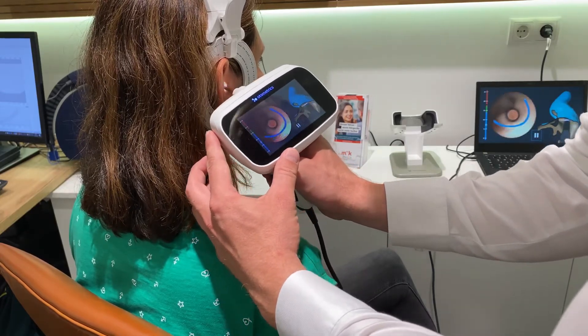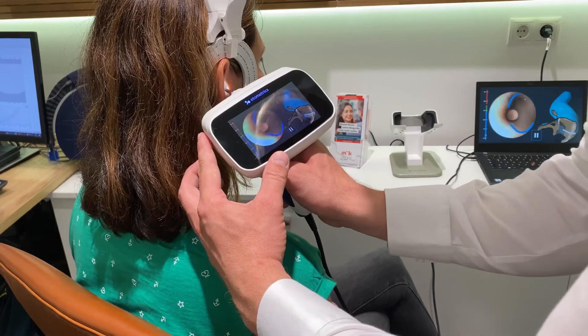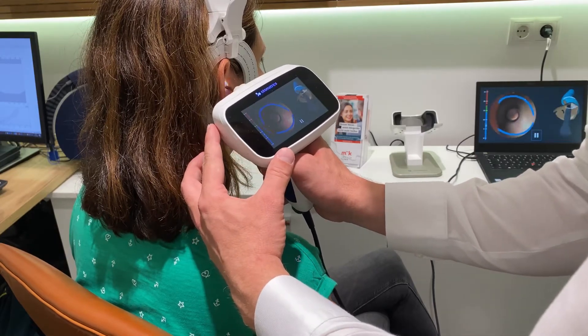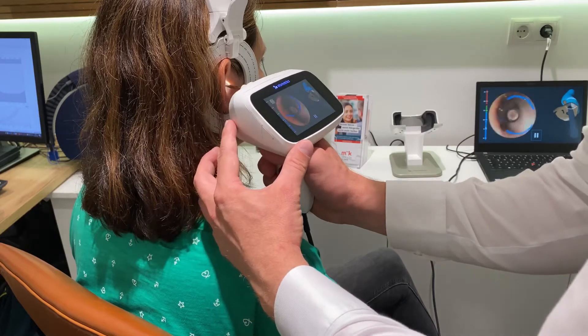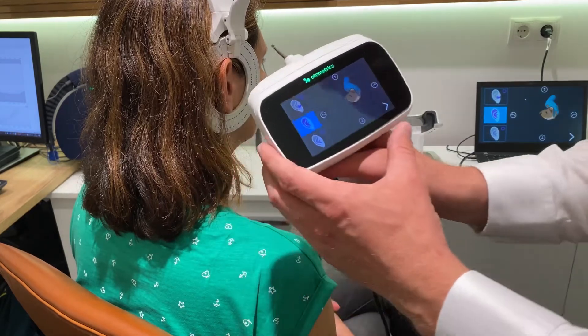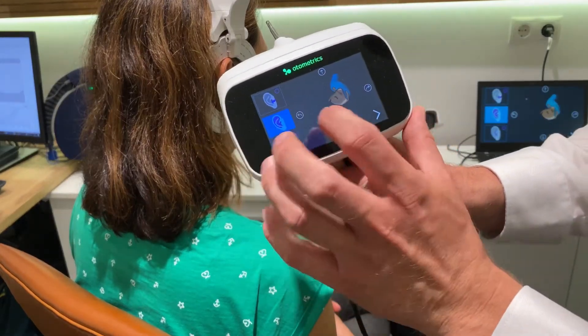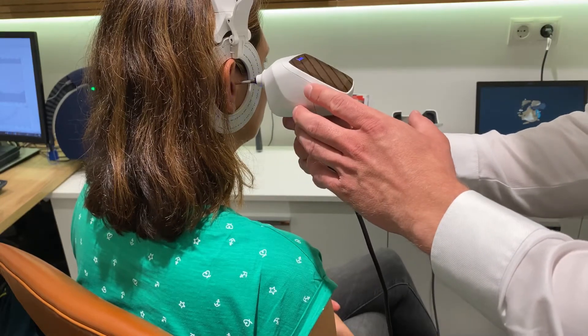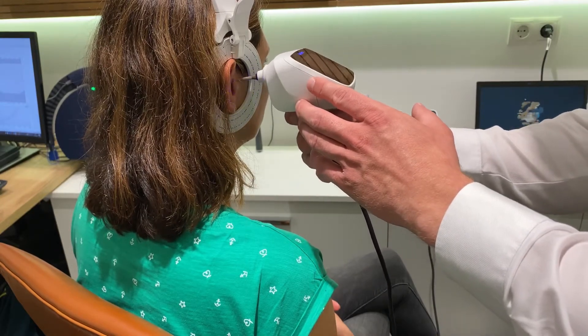In the past, with the regular impression, this sometimes may hurt the patient — let's say it was uncomfortable. And then I'm going out of the ear canal and I switch to the next scanner, so I can scan the ear, the pinna, from the outside.